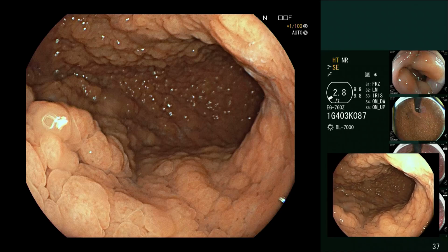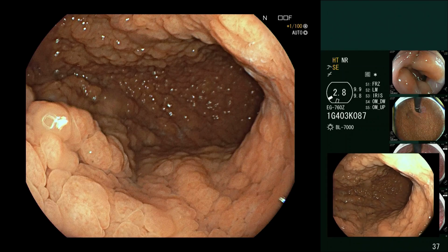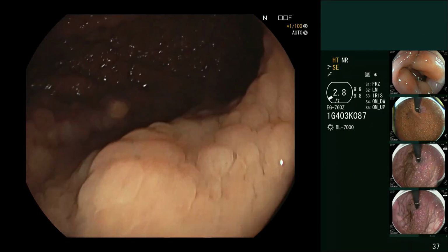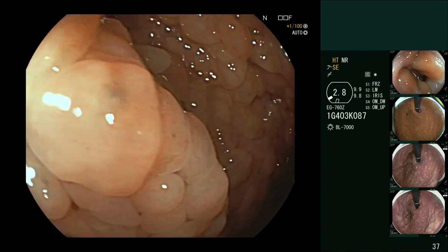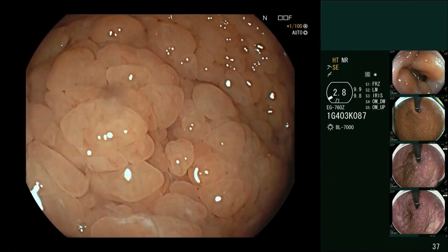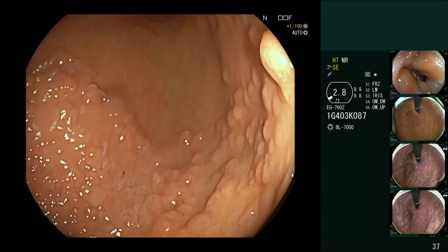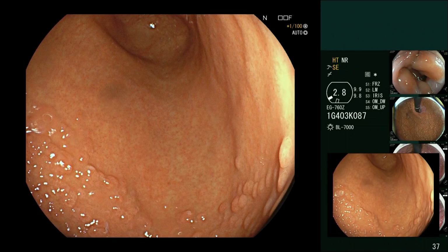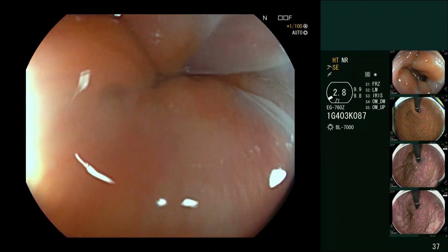So welcome. Have a look at this stomach, which looks maybe from first sight normal, but as you go up to it, it's pretty much one large fundic cystic gland polyp. There are so many of these. They're everywhere, and what is quite striking is that there's a line against the antrum where you don't see any of these fundic polyps anymore. So let's do a proper stomach inspection and talk about how to do it.